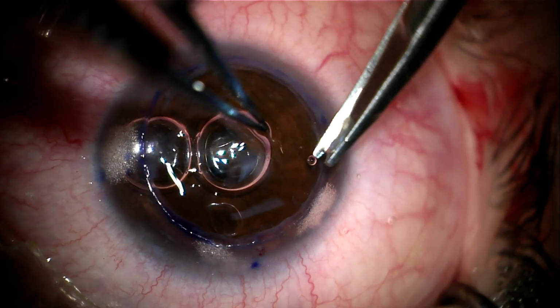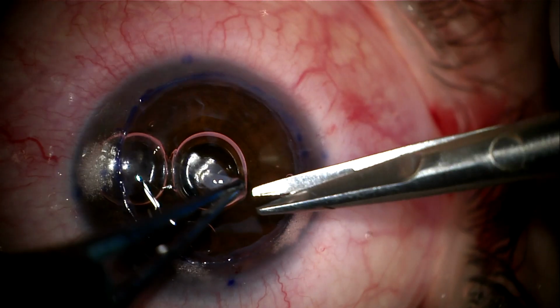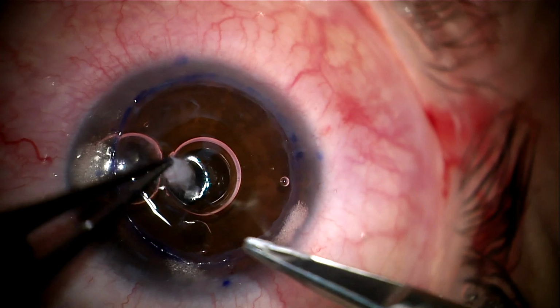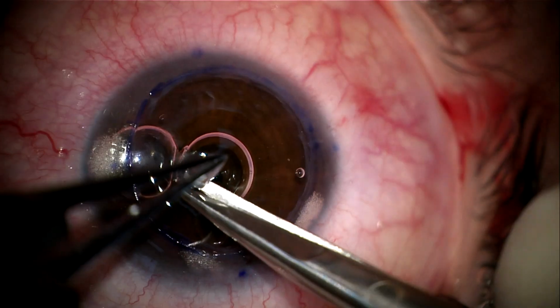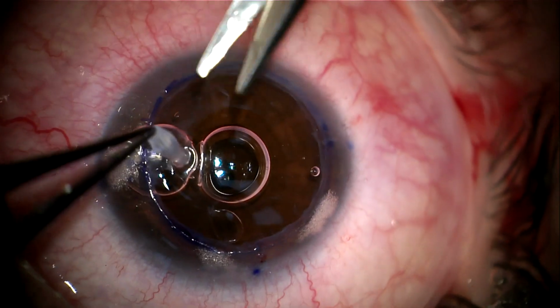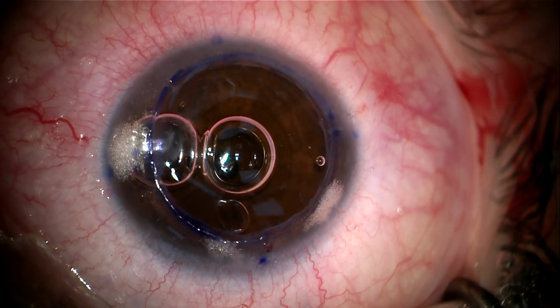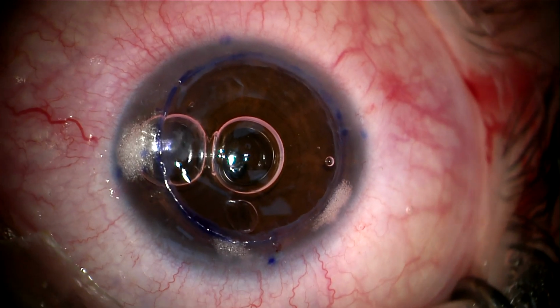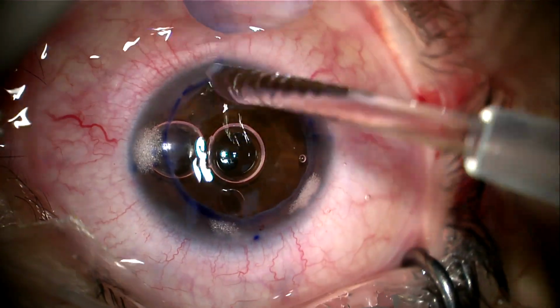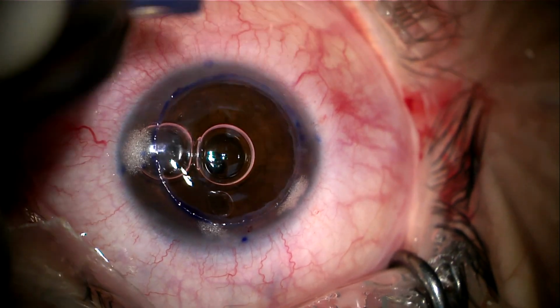This step should be done carefully, avoiding any increase in the intracameral pressure. The predescemetic layer should be held using a fine-toothed forceps away from Descemet membrane to avoid any possible pressure on the fragile Descemet membrane. So irrigation of the bed and the graft is then done. It's to be noted that the stream of BSS should be directed away from the central bare Descemet membrane.